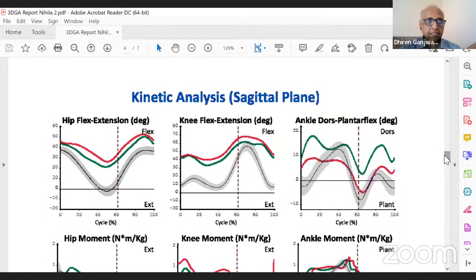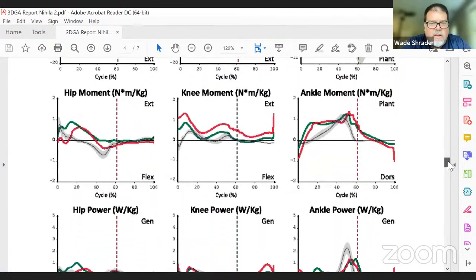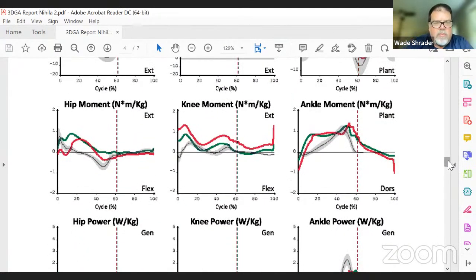Right. So this is where the kinematics data is. And can you tell us more about the additional information which we are getting? Yeah, so if we scroll down just a little bit, we can see the kinematics above, and then the kinetics are right below it. If you look at the scale of this, these are significant knee extensor moments through here, because normals are down in the gray. So it's exactly what we said before. There's a lot of internal extension moments having to counterbalance that ground reaction force that is causing even further knee flexion because of the overall plantar flexion knee extension couple issues.